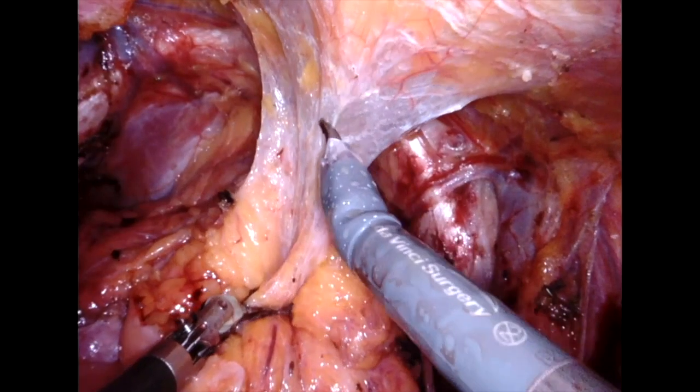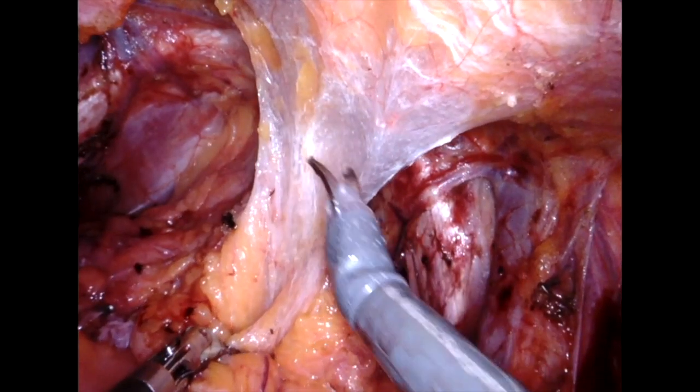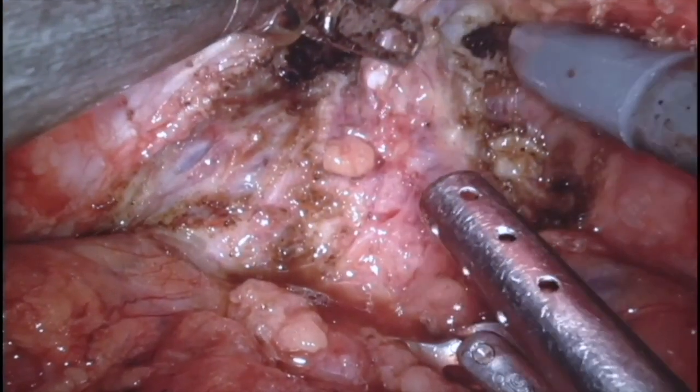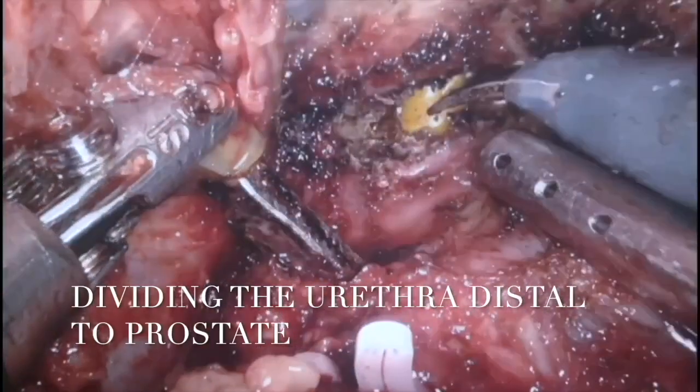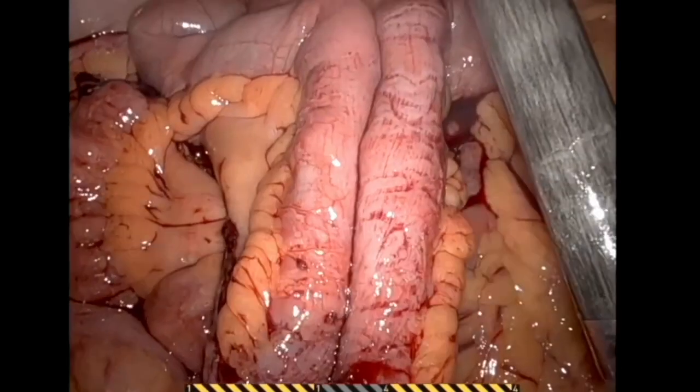Following this, we mobilize the bladder in the avascular plane in the space of Retzius and divide the dorsal venous complex down at the pelvic floor. Once that is done, we divide the urethra and proceed to fashion the ileal conduit.